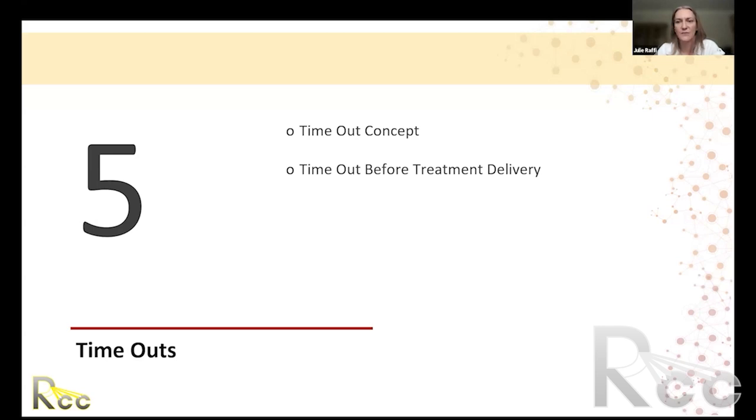Make sure that the patient positioning is consistent. You wouldn't want to just apply it one day and then go back to your original position the next day. So be very careful about not applying shifts for the rest of treatment if you haven't verified that they're appropriate and consistent. But you might expect to apply slightly different shifts each day if you have daily imaging. That's helping you fine-tune your treatment position to maintain those tighter margins.